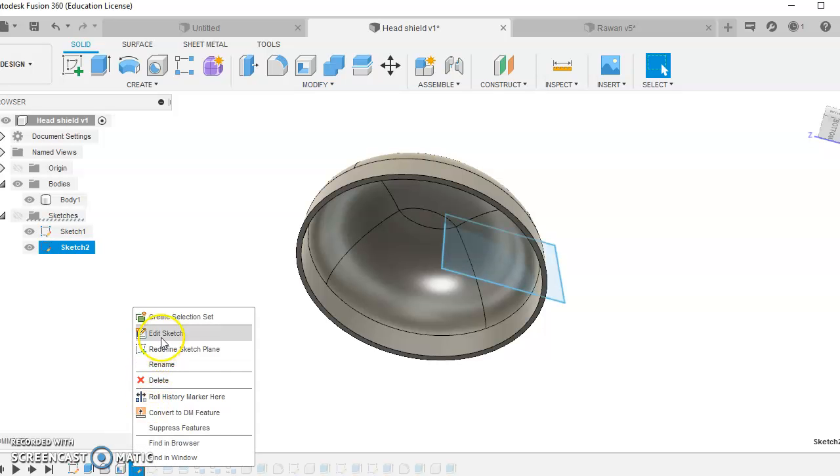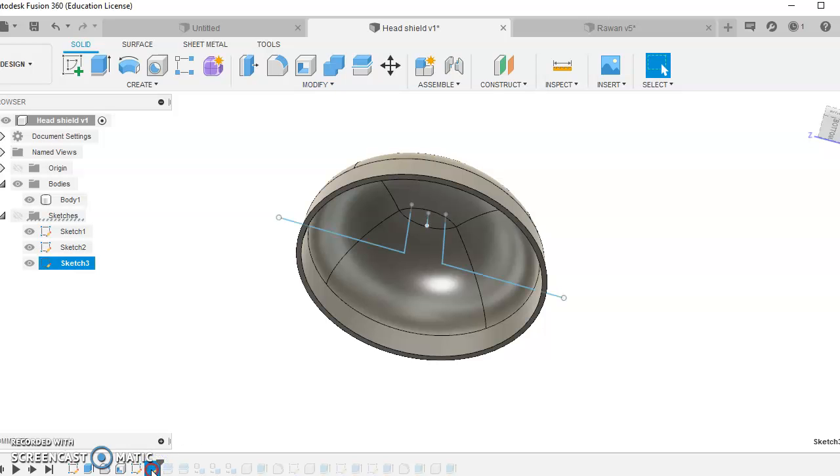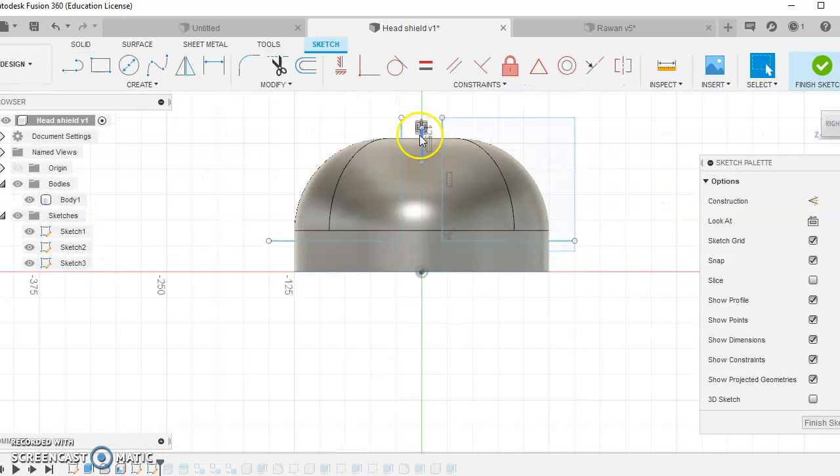Now here, if I go to Edit Sketch, you can see I've created a rectangular shape. I've got a center line next to it. I mirror about that center line. You'll see on the next sketch here, Edit Sketch. By mirroring about a center line, it means that I don't have to worry about the other side being an odd measurement. Now that it's been taken from the center, everything will be mirrored about that point. Just a good feature in any kind of design. If you use the CAD collectively and just use reference lines, X, Y, and Z coordinates, you'll get a nice reflection on that.